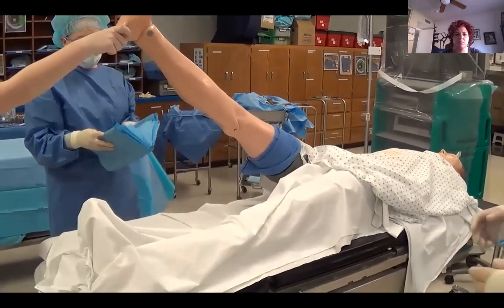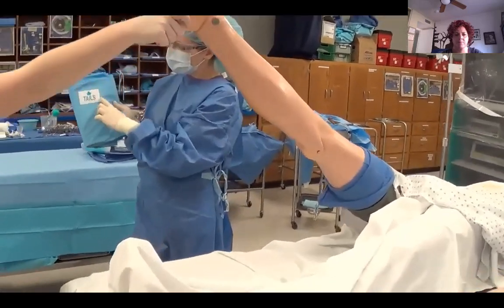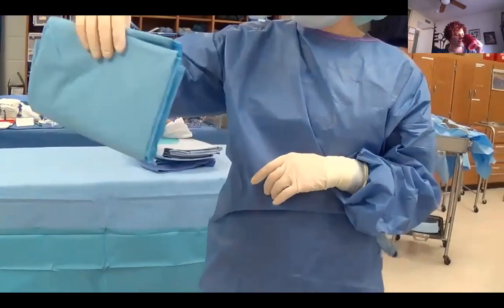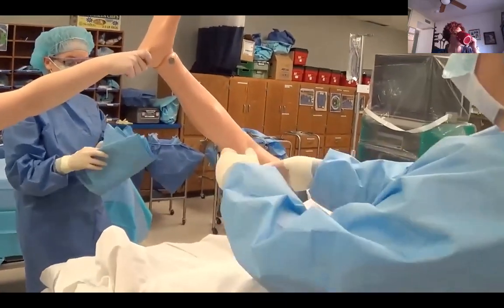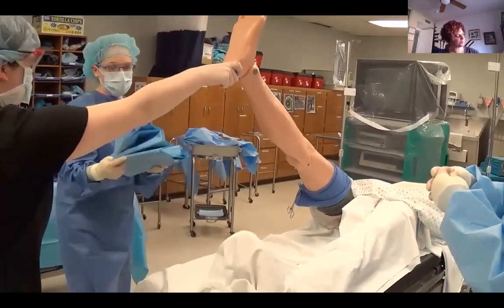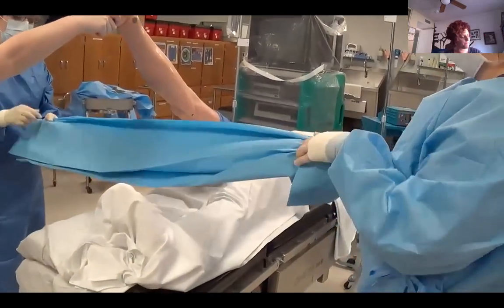So that's going to be the next item that we put on. So remember, the impervious split sheet is going to have some designation that tells you where the tails are or where the split is. So we want to make sure that we place that so that the tails are towards the tourniquet so that the opening is this direction towards the leg. Now your unsterile person is going to give you as much space as they possibly can. You're going to open this up and hand it to the other sterile person that you're draping with.